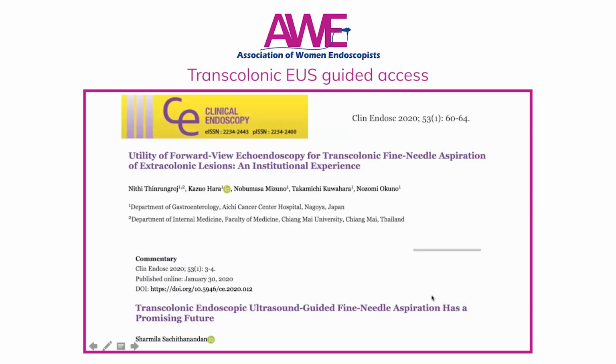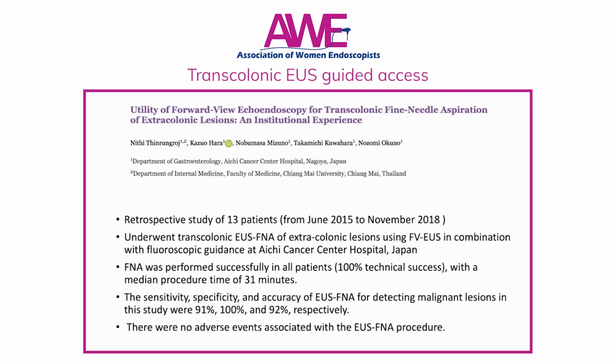I'd like to share with you the larger series of transcolonic evaluation with the forward viewing echo endoscope, and this is by Nithi and colleagues, published in Clinical Endoscopy in 2020. And this was all during the pandemic, and I was asked to write the commentary on this paper as well.